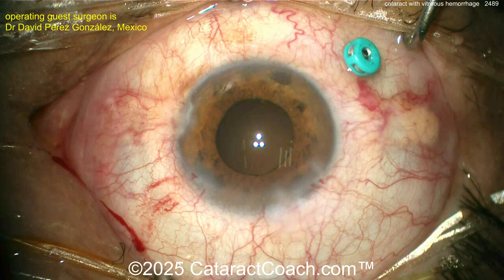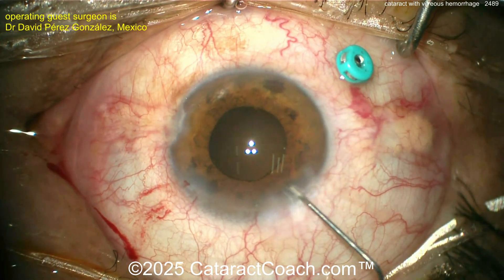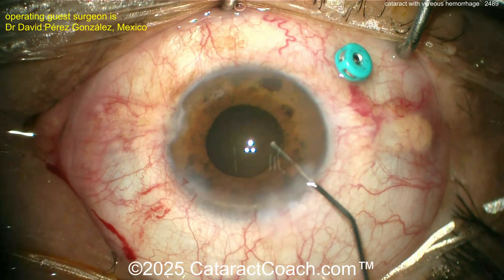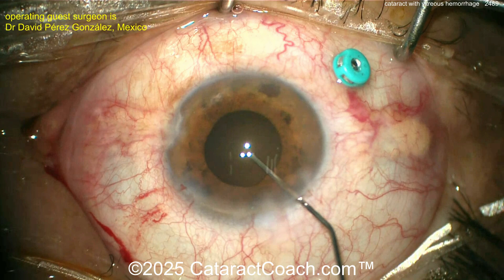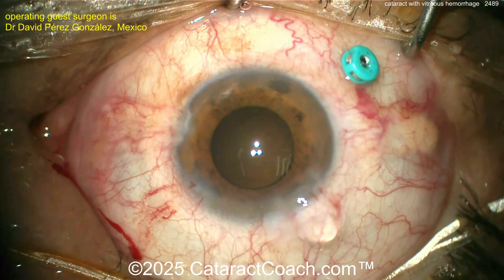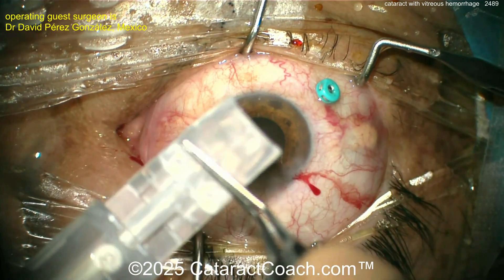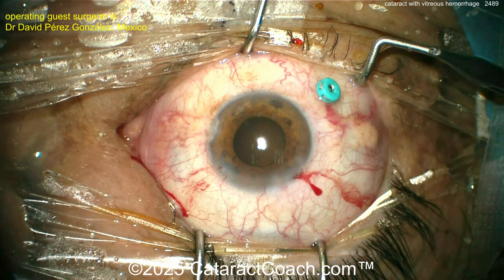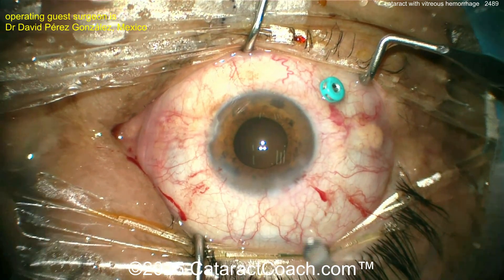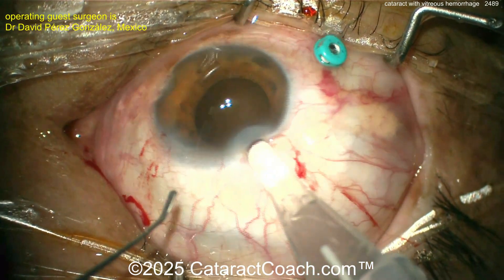Our guest surgeon here is also a vitreoretinal surgeon and will be doing a full pars plana vitrectomy to evacuate the vitreous hemorrhage. Here, filling up the capsular bag with viscoelastic — a patient with posterior segment pathology is going to get a monofocal lens. The capsular bag is nicely expanded. Here comes the lens — looks like a single-piece acrylic lens — getting that delivered nice and easy. This patient will then have a full pars plana vitrectomy to treat the concurrent retinal disease.